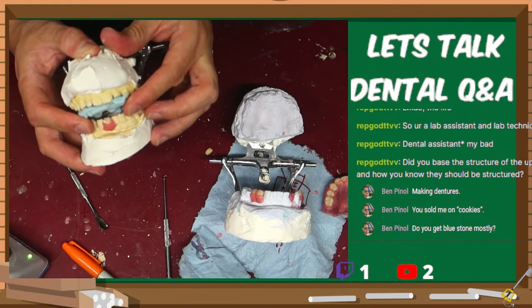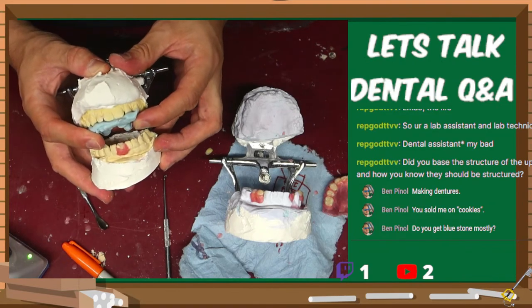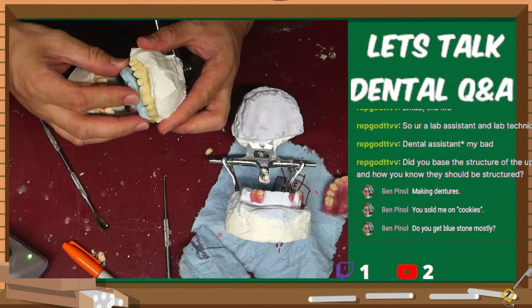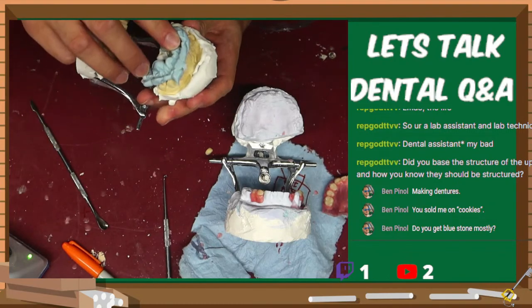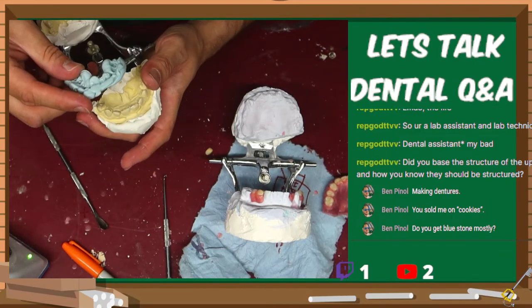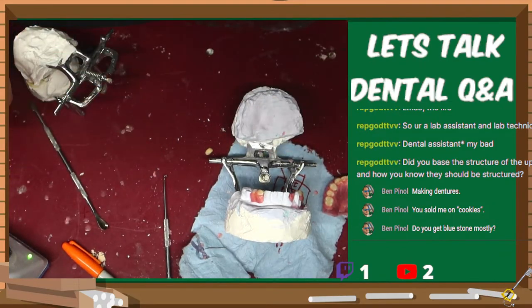Yeah, if I have this bite registration for this person and I pour up these models and have them bite together like they hopefully should, does this go to this person? This one does not go to this person. Who does this go to? That goes to this set.